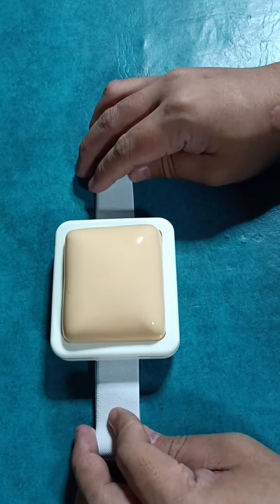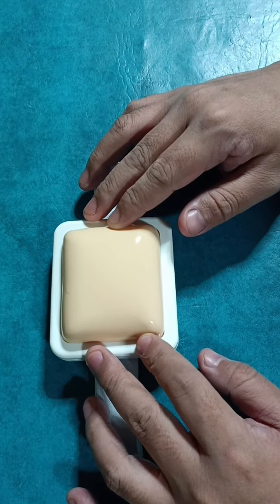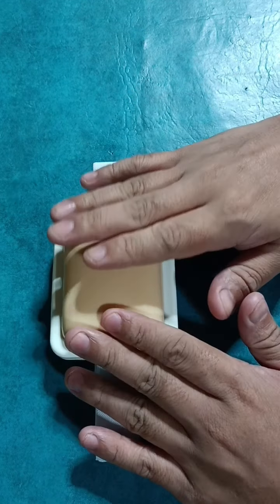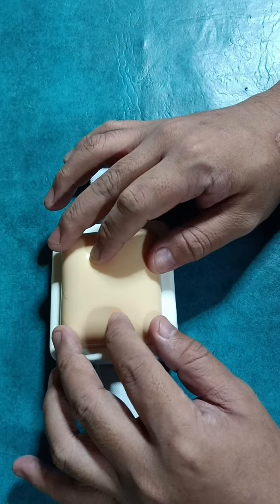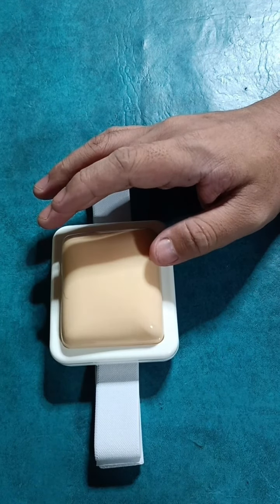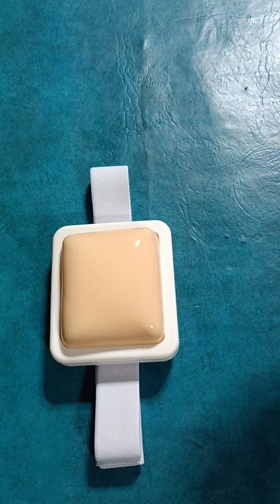Select the site free of tenderness, hardness, swelling, scarring, itching, burning, or localized inflammation. For example, let's imagine that this is the abdomen part. Then select the site that has not been used frequently and then apply gloves. So we will apply gloves.